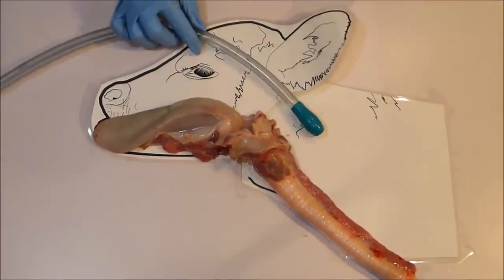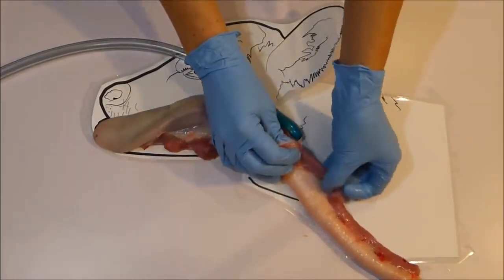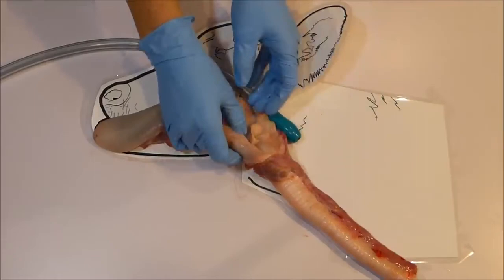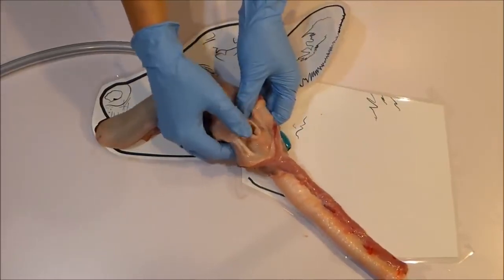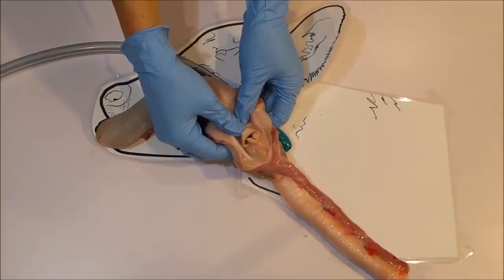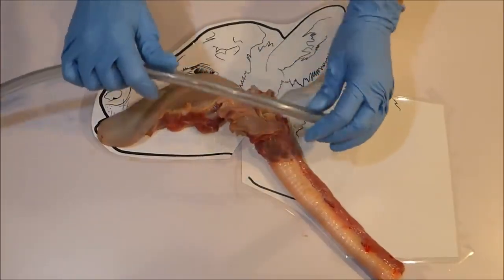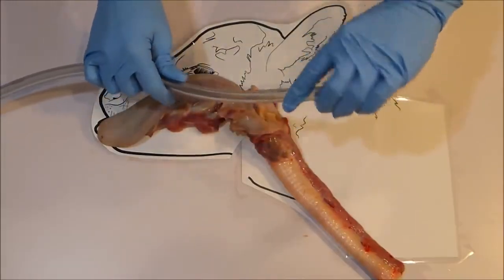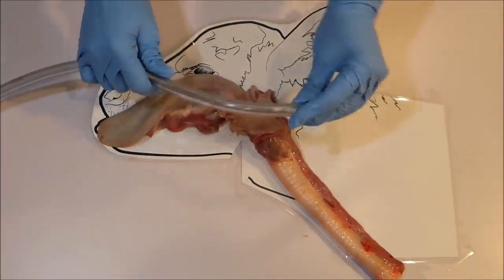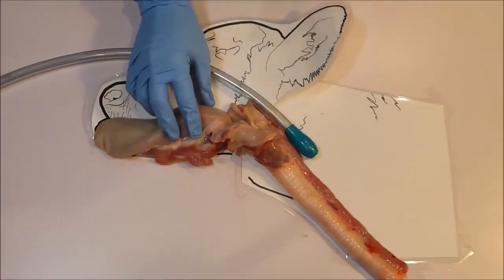Lastly, you can see how delicate the associated tissue is. The esophagus is very thin and the structures around the throat are fragile with limited blood supply and pretty poor healing ability. This is why it is important to be gentle and use gentle equipment, particularly a flexible tube which will move with the calf, preventing soreness or injury which will slow recovery and drinking time for your calves.